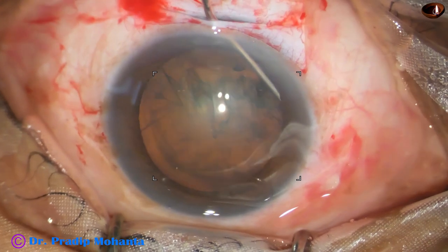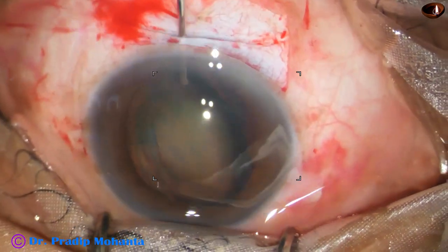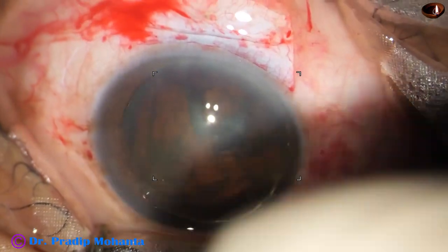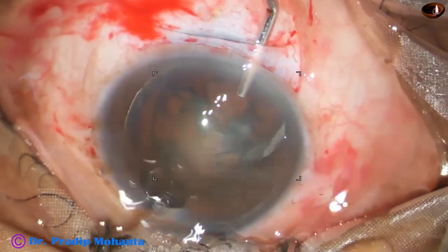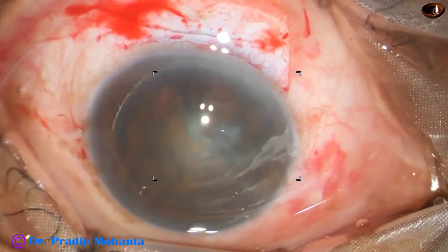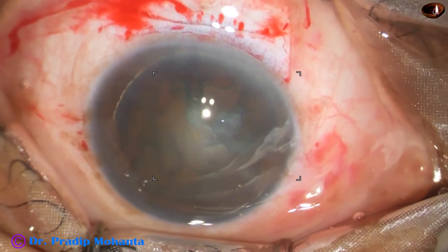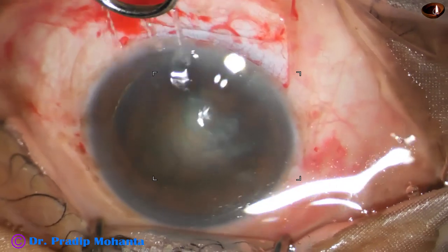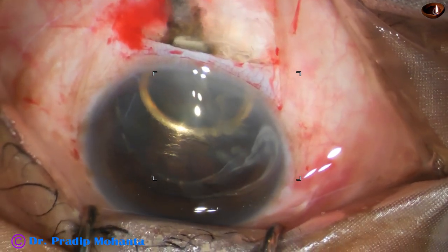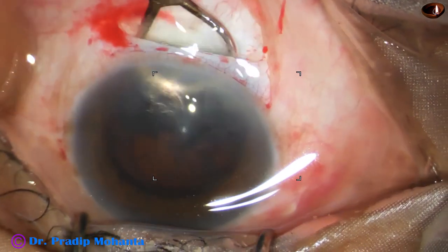Now hydrodissection is performed. The capsulorhexis is large so one part of the equator comes out of the bag. The hydrodissection cannula itself could prolapse the nucleus in this case. Visco is placed anteriorly and posteriorly — anterior to the lens mass to protect the corneal endothelium, and posterior to make space so that we can introduce the irrigating vectus, which is attached to a bottle, not a syringe, to gently deliver the nucleus.